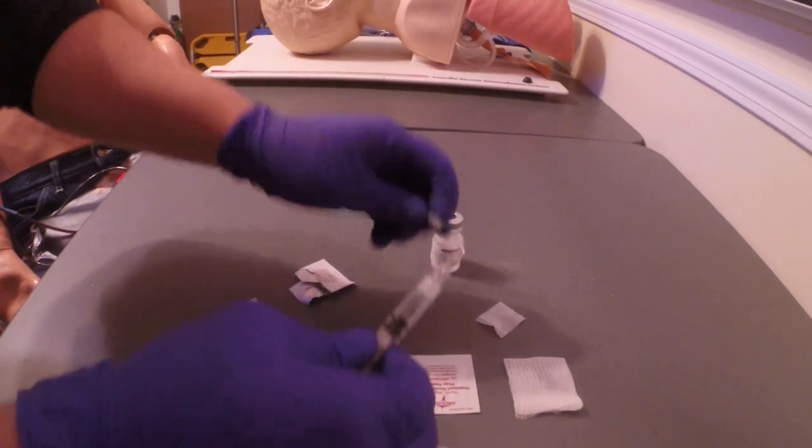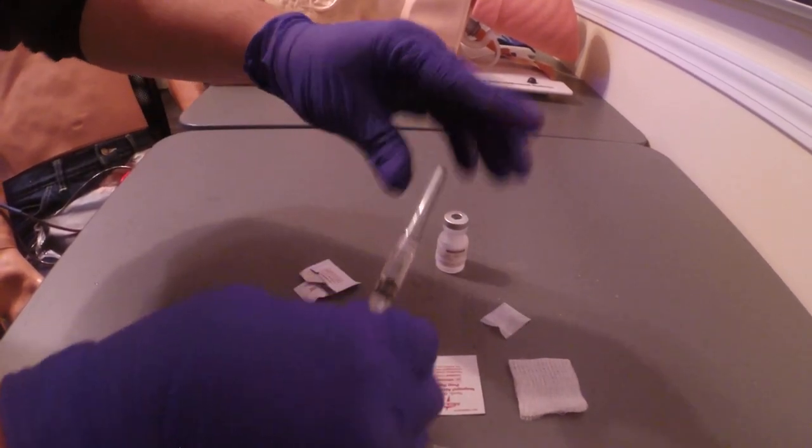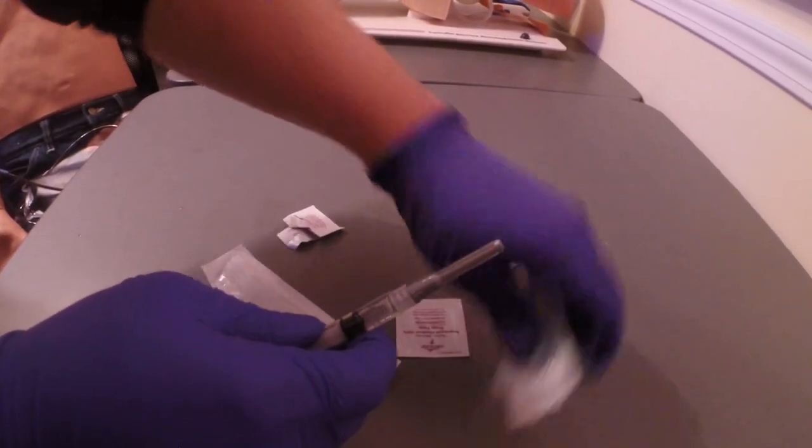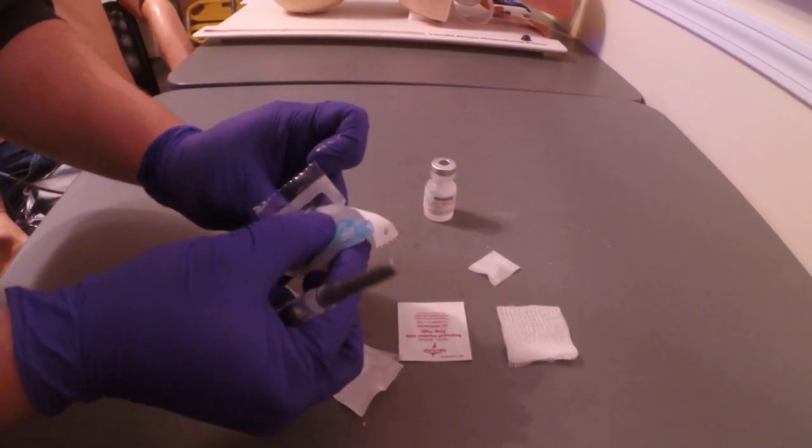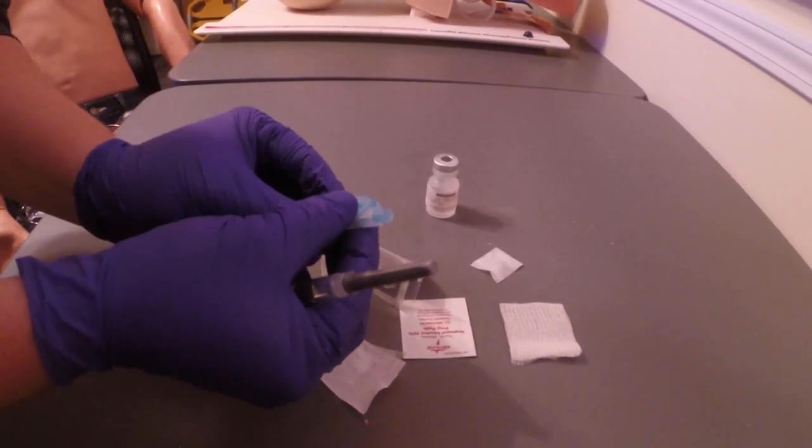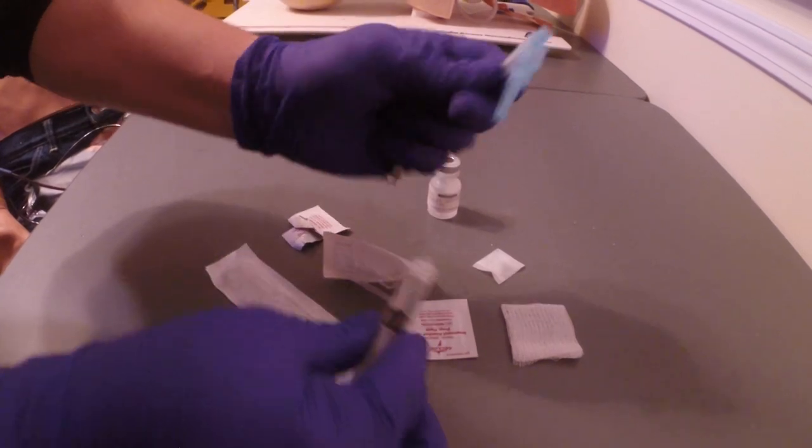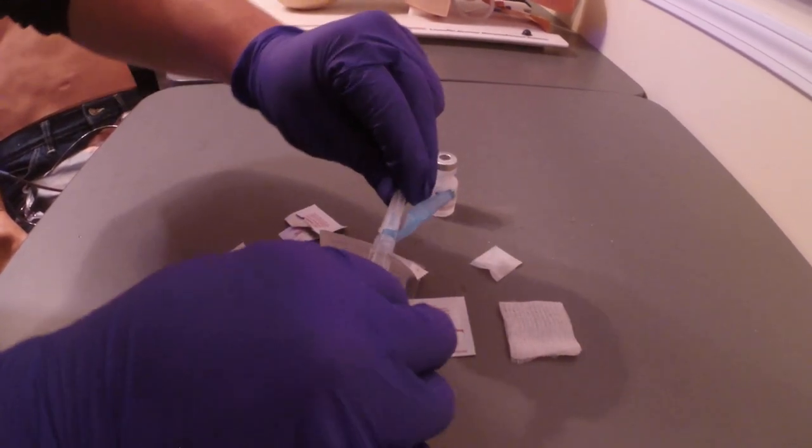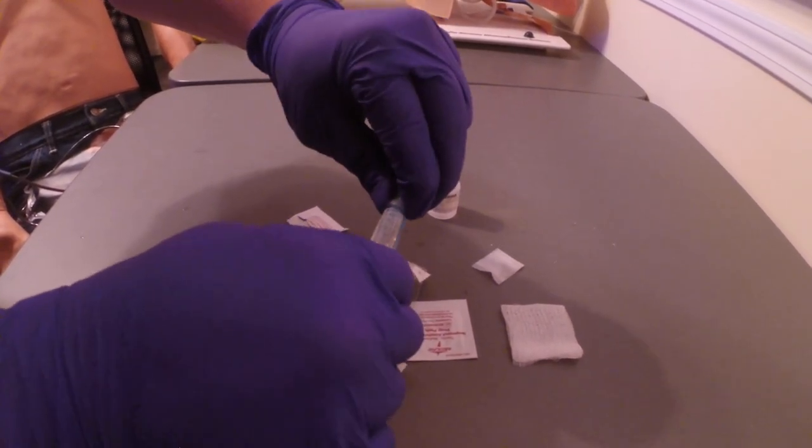Remove the vial, recap your blunt cannula, open up your needle, remove your blunt tip and attach your needle.